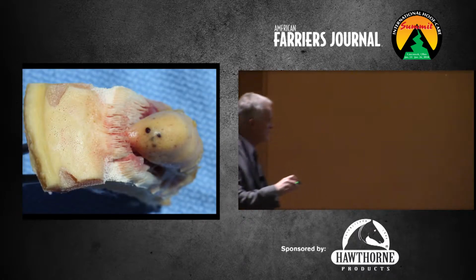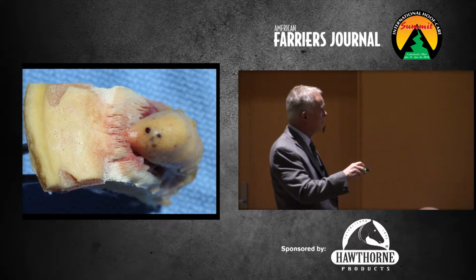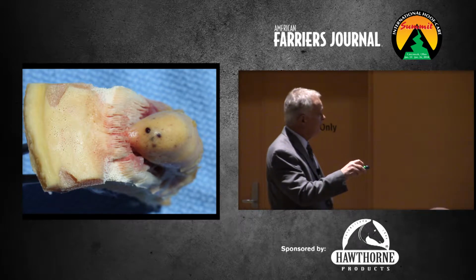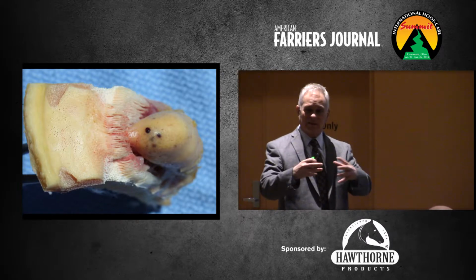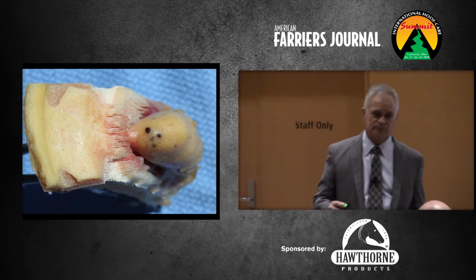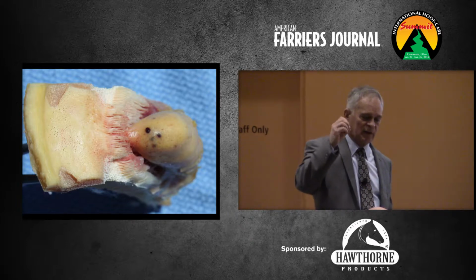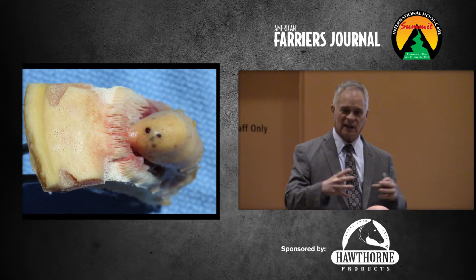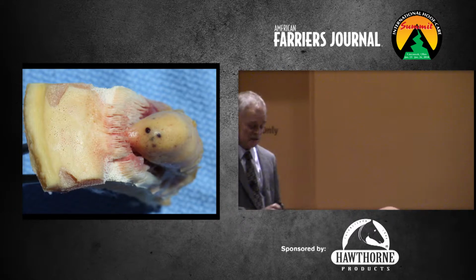Okay. Looking at it from the top, coronet. Here's our epidermal lamellae. You can see the little tubules where the papillae from the coronary corium go in. And here's our keratoma, and if you notice, here's the little origin of it coming right up here. So it just starts there and then comes down and just keeps getting bigger. That one I just call a tumor, and we presume that wherever they started, we don't know why or what, but one abnormal cell multiplies and multiplies, and they get bigger and bigger, and they just get pulled down with the hoof that they're attached to.